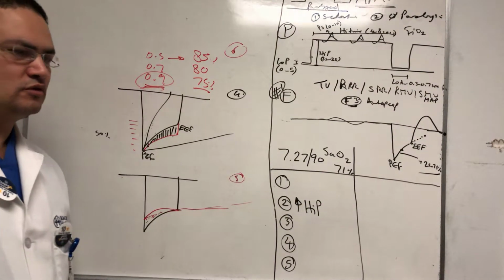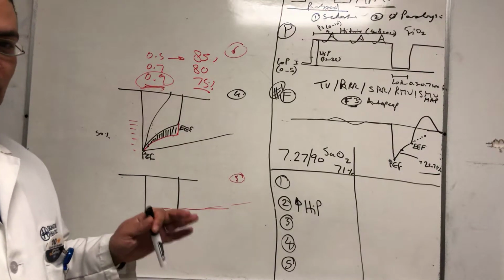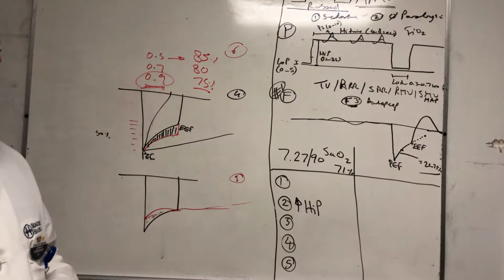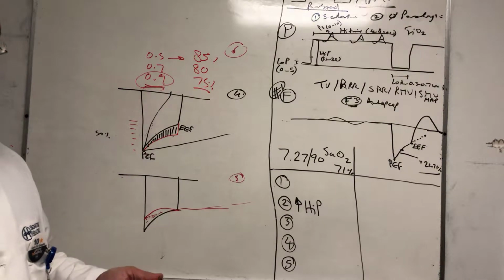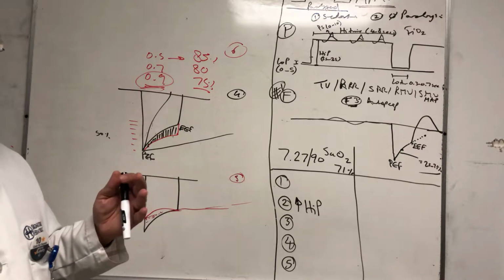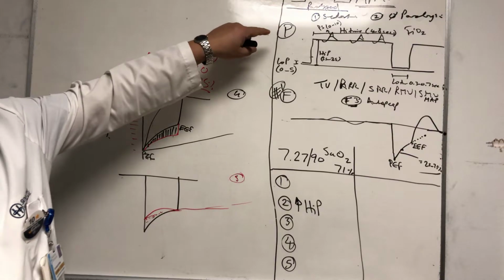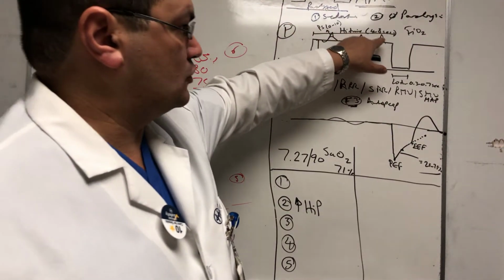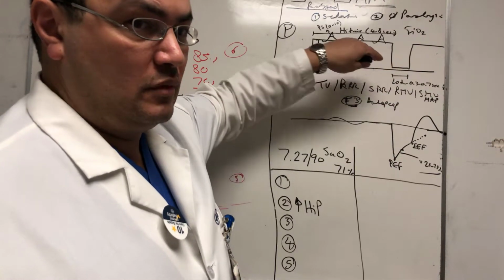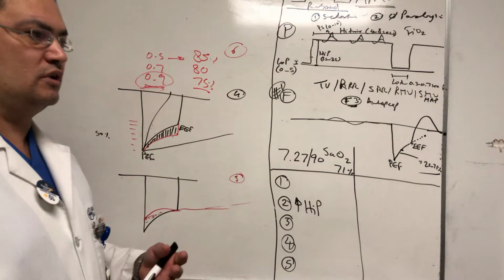Some stupid modes of ventilation call it high PEEP and low PEEP, which confuses everybody. But the real name for it is high pressure and low pressure. So there's no PEEP. So conceptually, where is the PEEP? The PEEP here is actually closer to the high pressure. Why? Because I'm spending more time on the high pressure and negligible time on the low pressure. So the majority of the pressures are close to that pressure. Again, there's no PEEP, but conceptually it's close here.